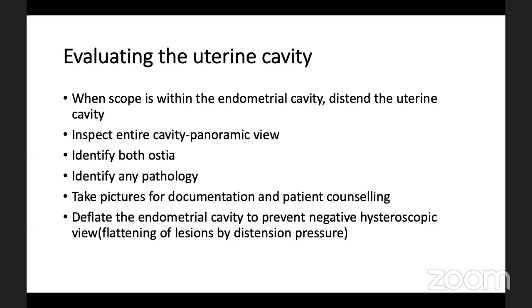Especially when you're a beginner like some of us, familiarize yourself with what the normal hysteroscopic cavity looks like where there's no pathology, what it looks like in the premenopausal era, what it looks like in the postmenopausal era. So when you see anything that's different from that, you can easily pick it up. Because sometimes we do hysteroscopies and we call them negative, but sometimes I feel that we do actually miss pathology.